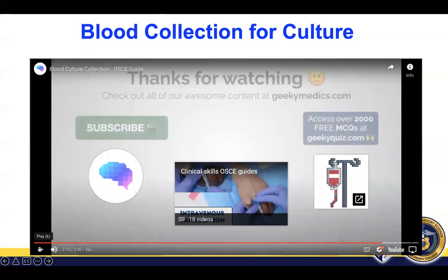So if you noticed, the technician used the butterfly technique or method. That's okay, really, but it's usually used for those with coagulation problems or bleeders.